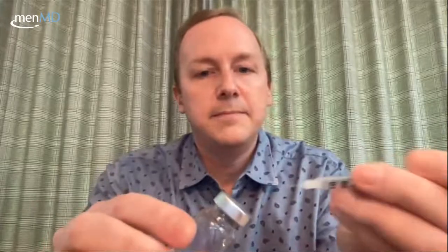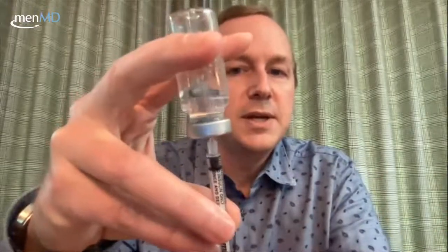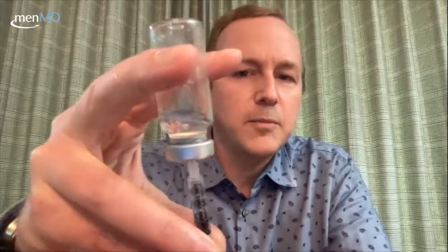One thing I want to mention again: I didn't draw up air before going into the vial. Let me demonstrate that. You can draw up air to the amount you're going to inject — say 30 units — then enter the vial, push the air in, and then pull back to draw up your dose. You don't have to do this; I didn't the first time and it was fine. This is more relevant when doing large volumes. If we were mixing meds using a 30cc syringe, it becomes more important to equalize the pressure in the vial. So that's how you fill with air first, inject it in, then withdraw — and I've got 30 units again.